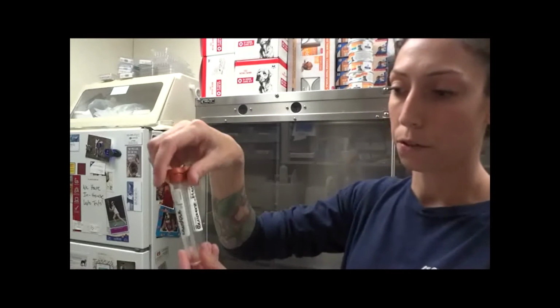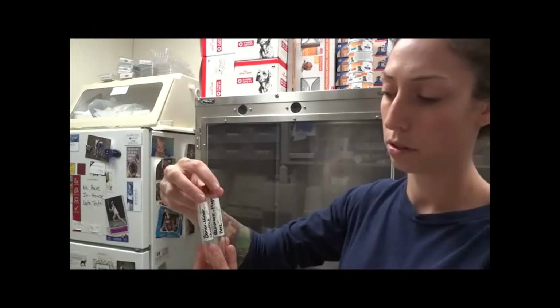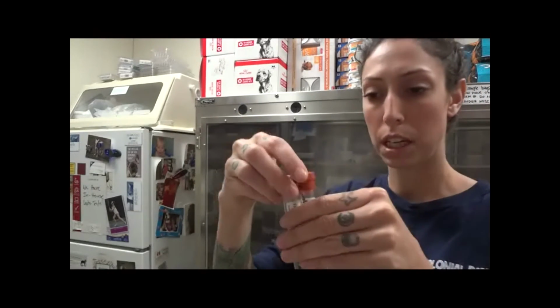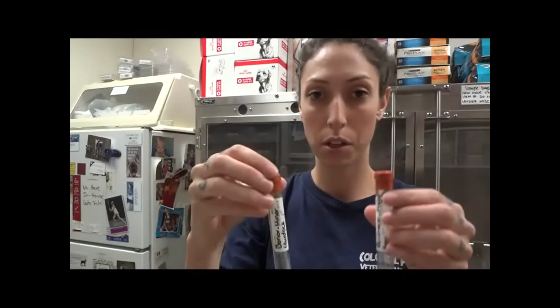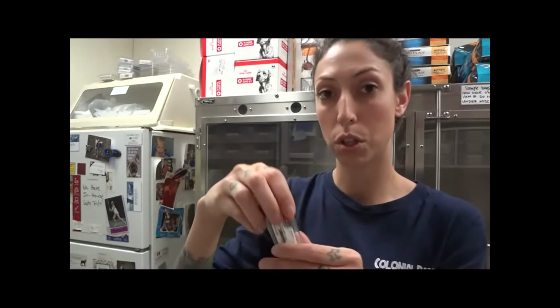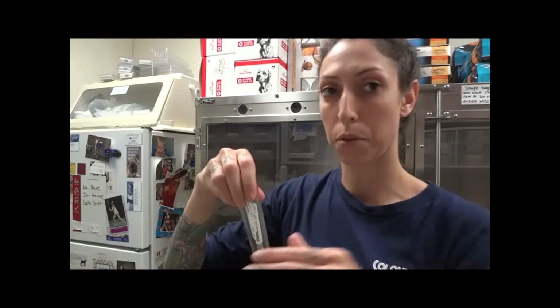Here I've got some centrifuge tubes that we'll be using, one for the donor, one for the recipient. I've got 2 drops of serum for each donor and recipient. And we're going to place 2 drops of the erythrocyte wash into these. We're also going to make 2 controls, each with 2 drops of the recipient's serum and the recipient's erythrocytes, and the donor serum and the donor's erythrocytes. Then we're going to spin it down.